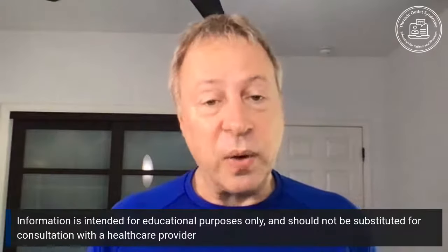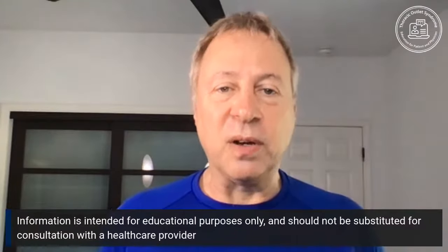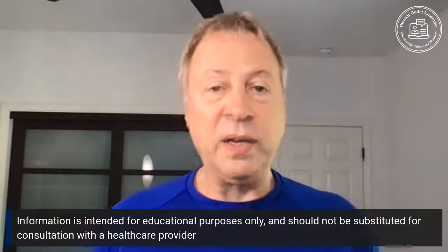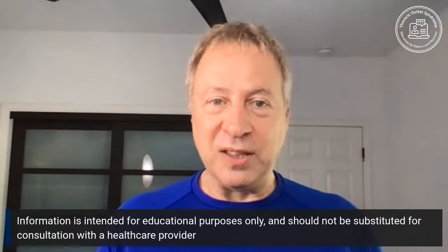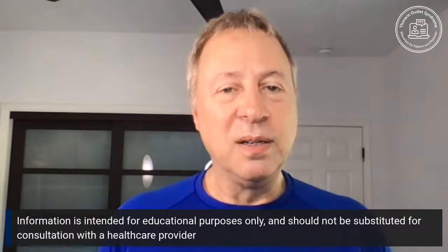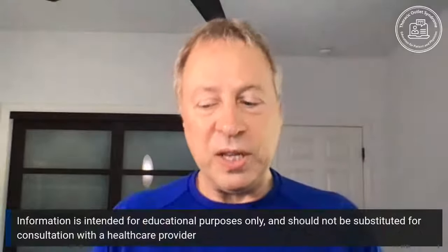Let's go on to the second question, which is, what would a perfect diagnostic imaging test show for patients with thoracic outlet syndrome? Well, I made a list here. I'm just going to read off to you. It'll make sense if you've followed our studies on anatomy, etc. Number one, you'd want to see the spine, because remember, the nerves start in the spinal canal. They start in the spinal cord, which is in the spinal canal. They have to leave the spine through all these little bony holes, and you want to make sure that the nerves are not pinched as they go and they spread out through these holes and they cross into the side of the neck. So you want to see the spine.